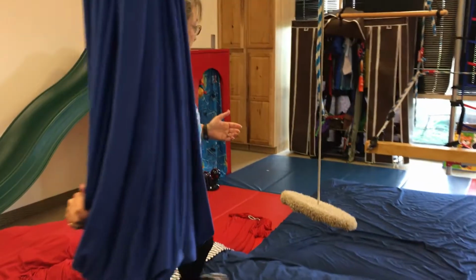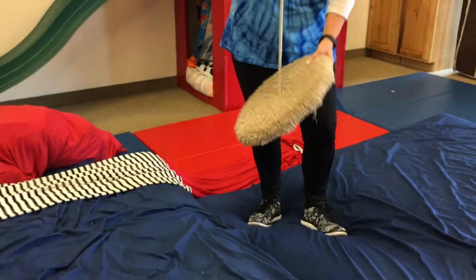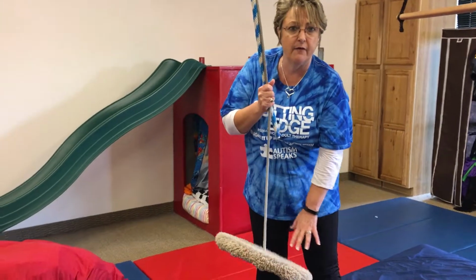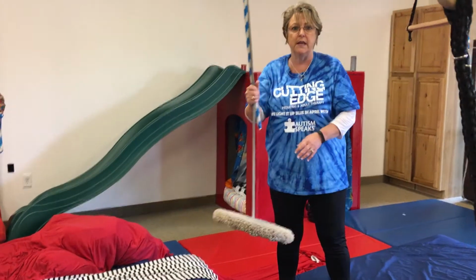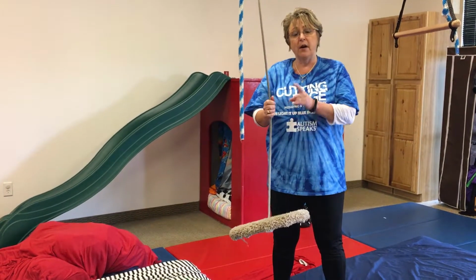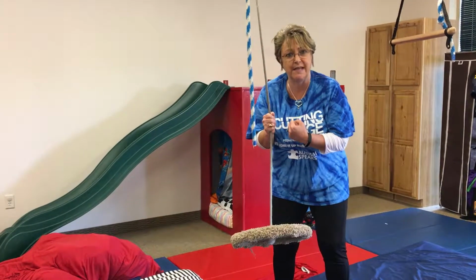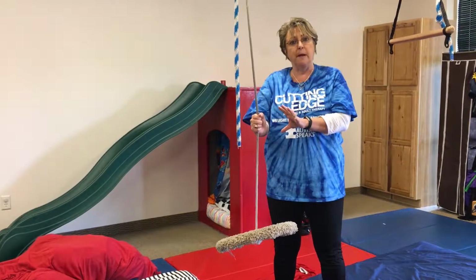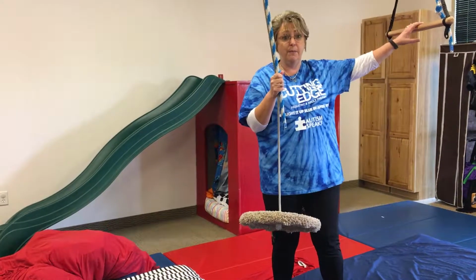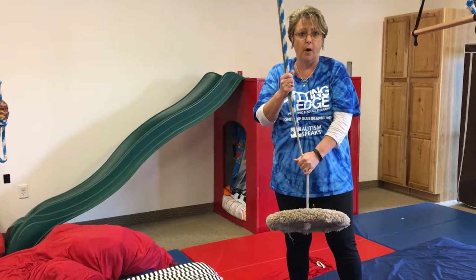So our next swing in the lineup is a disc swing, and most of you have seen a swing like this. Little Tikes makes ones that are plastic. We have carpeting on it because a lot of our kiddos end up falling off, and we don't ever want them to get injured, so we have everything probably more safety reinforced than the average thing. But this is a swing you're just going to sit around and flex your legs together. A lot of our kids have such poor core strength, they're not able to hold their body in flexion, which is that pattern you need to hold on to this swing. And many of them can only do it with their hands, but then when we ask them to remove their hand and reach for a trapeze bar, they can't hold the rest of their core strength to do that. So this is a swing we're working on core, okay?